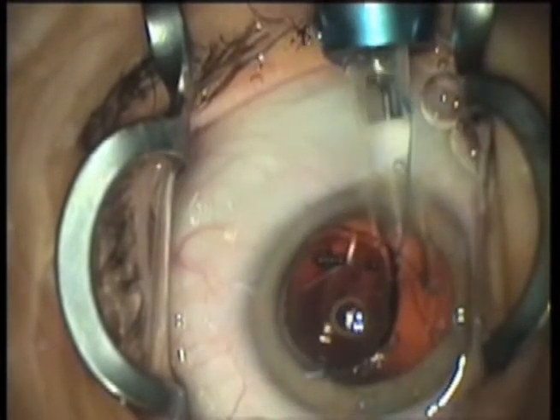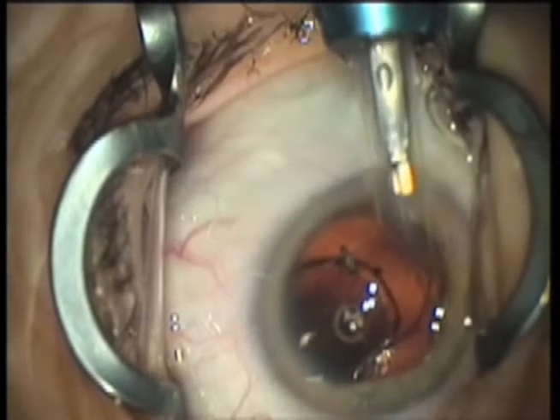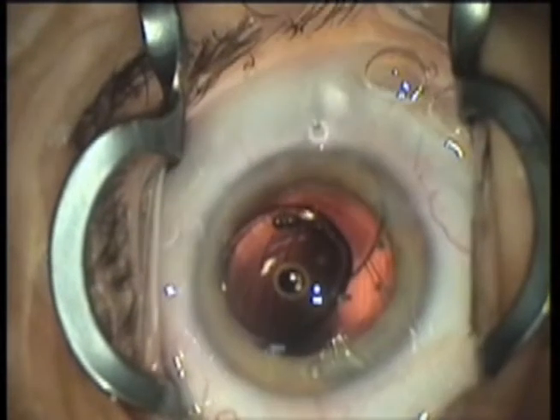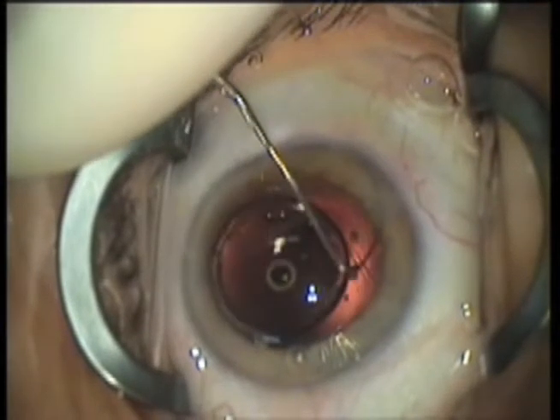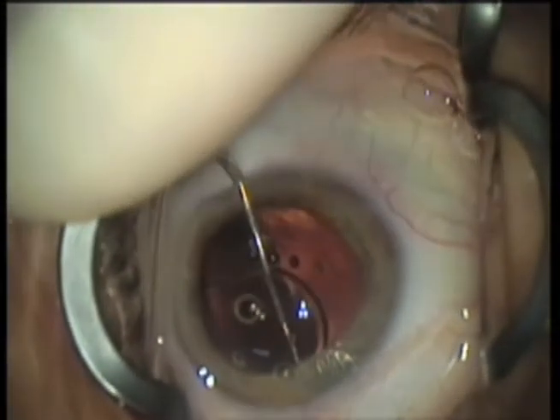To be sure that the haptics are inside the sulcus, inject the lens first into the anterior chamber. Then, with the spatula, place the haptics one by one just behind the iris.